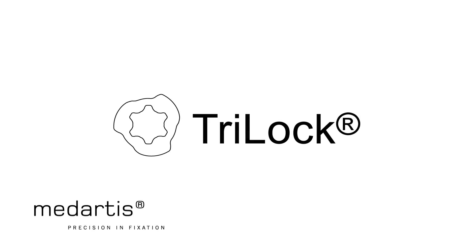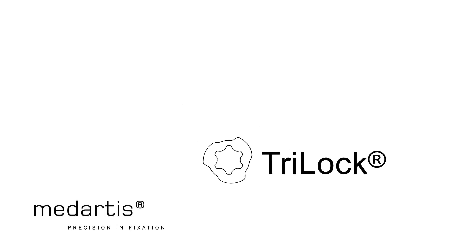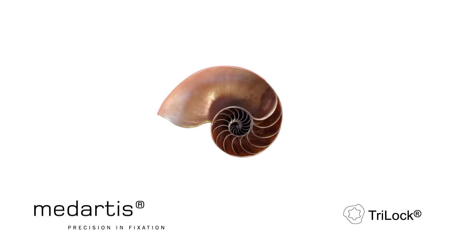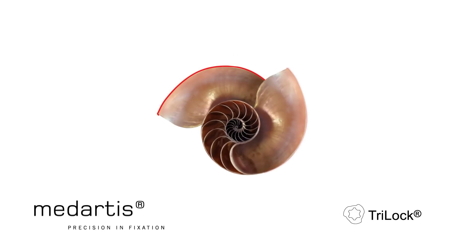The Tri-Lock locking technology, as patented by Medartis, relies on a friction or radial force connection between the screw head and the congruently designed internal contour of the individual plate hole.